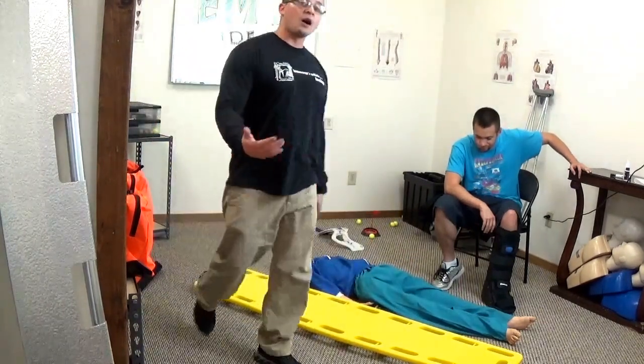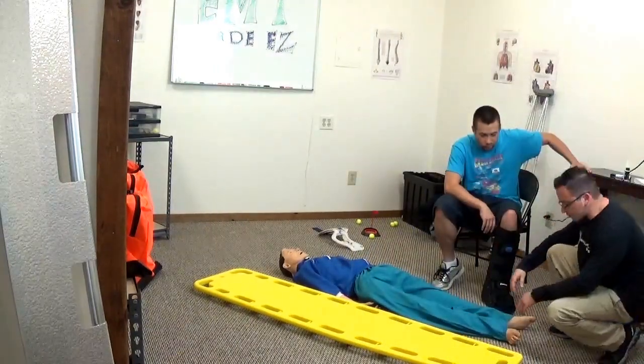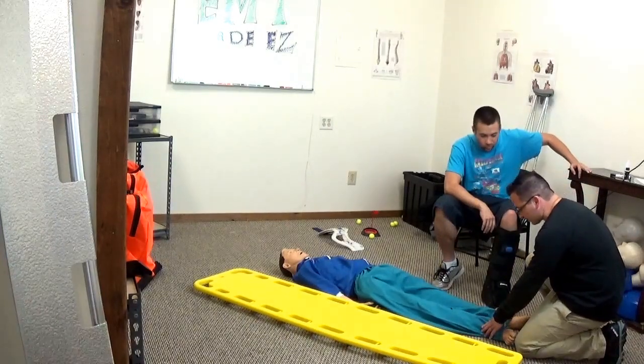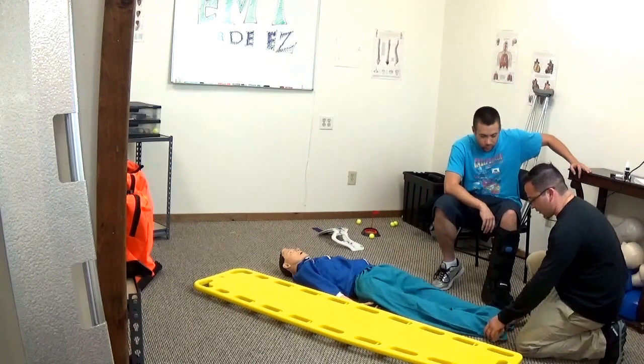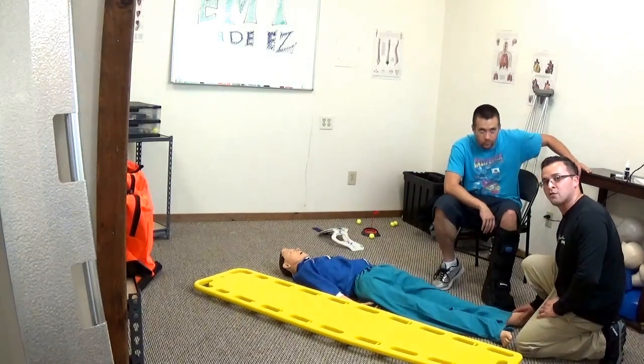After you check the upper extremities, go down to the lower extremities and also check for CMS. Check for pedal pulses or capillary refill — either one is good. Tell the patient to press down, push up, and then ask them which toe or which foot it is you're touching.